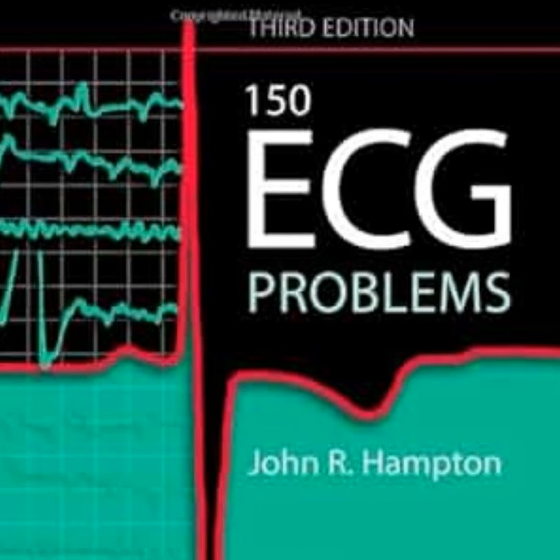That is wild. So the ECG displays this terrifying electrical storm, the rapid, irregular rate, and the wide complexes. But the root cause was actually a spirochete infection years prior that destroyed the vascular plumbing, which then eventually destroyed the electrical wiring. It just perfectly reinforces every single lesson Hampton tries to impart. The squiggly lines in the ECG are merely the final downstream symptom of a much larger, highly complex human narrative.